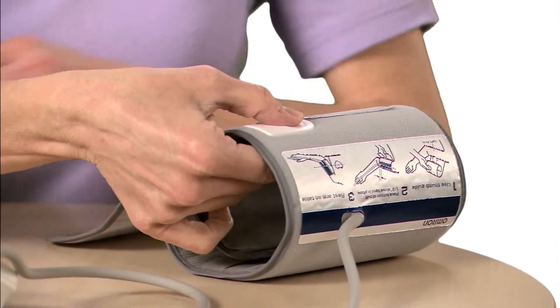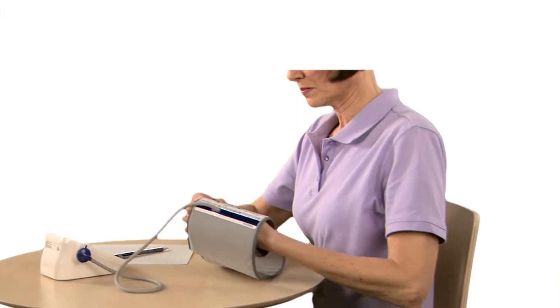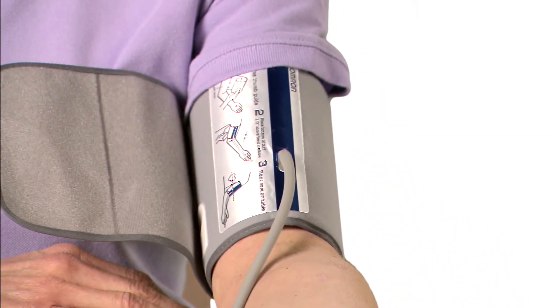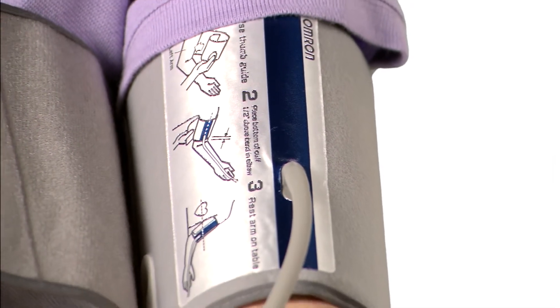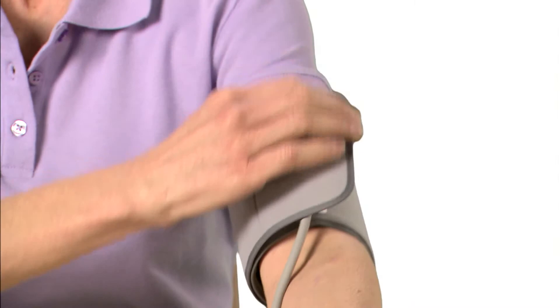Hold the grip on the cuff securely with your right hand, placing your thumb on the thumb grip. Place the cuff directly on the bare skin of your left upper arm. Make sure the air tube is on the inside of your arm. Align the bottom of the cuff approximately one half inch above your elbow. Make sure the blue stripe is centered on the inside of your arm, with the tubing pointing down towards your hand. Close the cuff snugly.